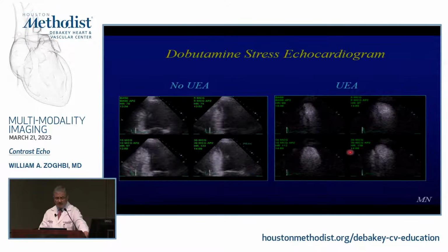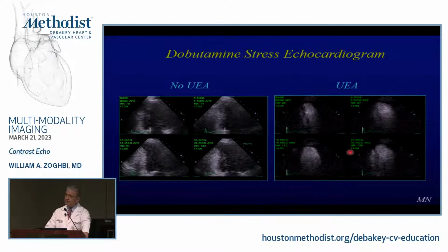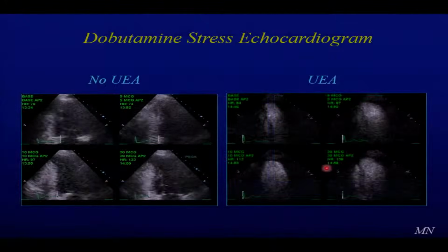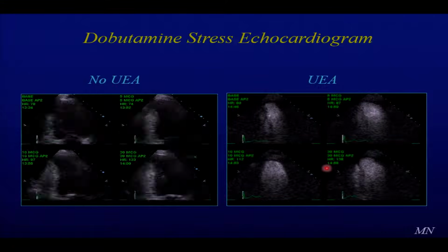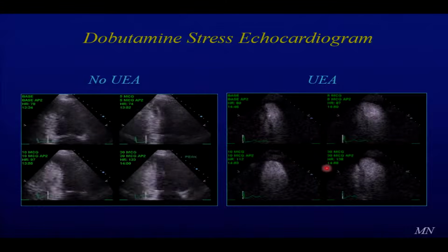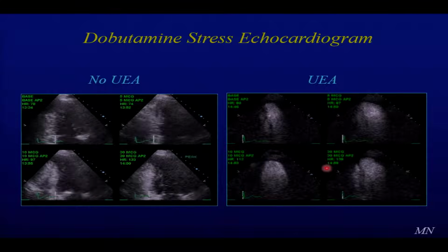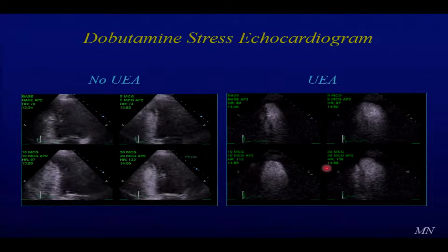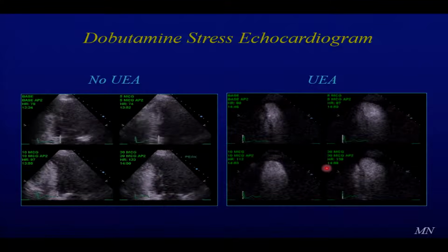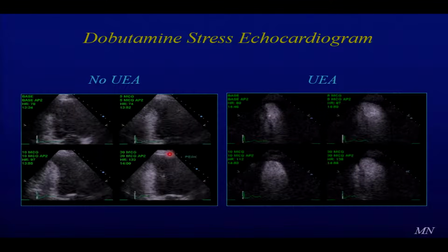So take a look on the left side, and you tell me, this is a stress dobutamine. This is actually one of these patients. How do you interpret it? This time there is silence. Anything. Is it normal or abnormal? In truth, I think it's abnormal. I know you're non-committal today, but that's okay because you may be hypoglycemic.